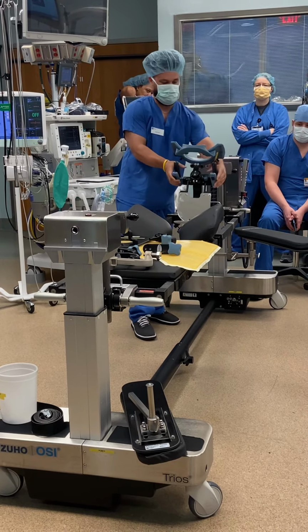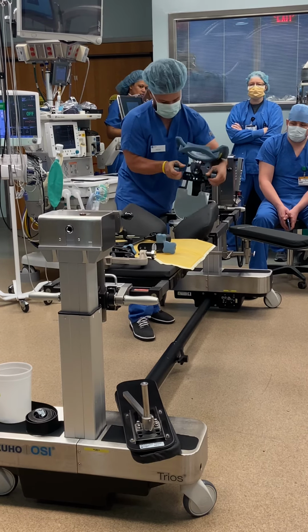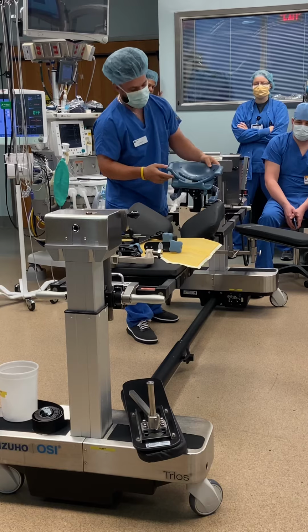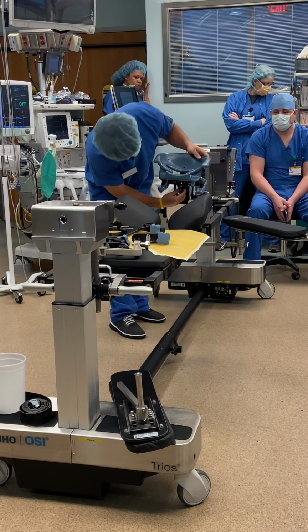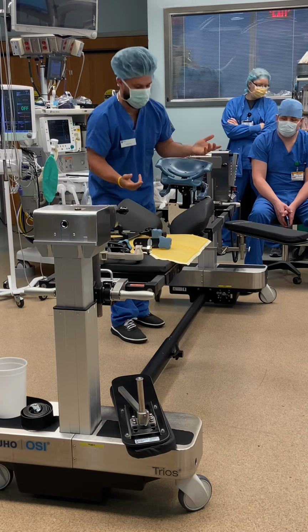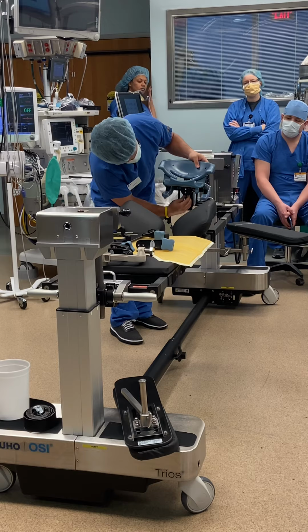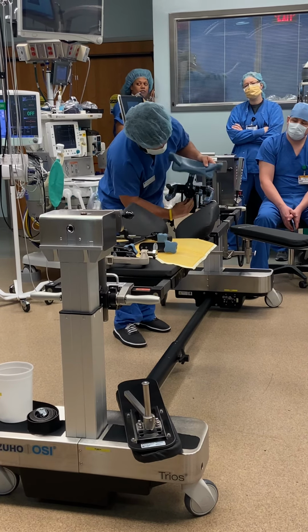Once that's nice and secure, you're able to grab these little hinges right here, both right and left, and position it the way you'd like. If you ever want to remove an attachment and replace it with something else, we have two little metal, I don't have a specific word for them, but I call them little pinchers right here at the bottom. You pinch them together, and then you're able to turn the knob, loosen it up, and remove it.